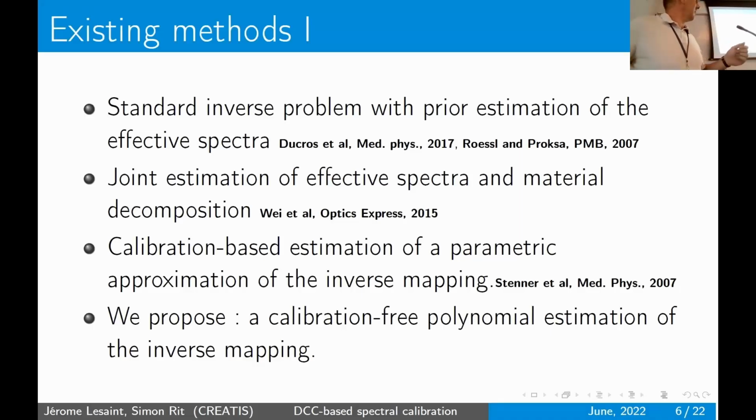If you don't have the effective spectrum, you can jointly estimate, in one single inverse problem, both the effective spectrum and the sinograms.